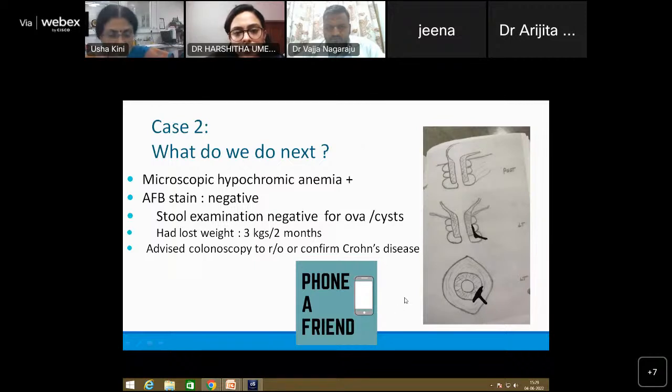Syphilitic lesion? She said, okay, I'll ask, and she said serology was negative. Sorry, it didn't occur to my mind. They have not done it, but she's doing well now, because that was not at all in their differential, as the histology was not of primary syphilis. They're all very rare of late because of the very good third generation antibiotics that we have in the market.